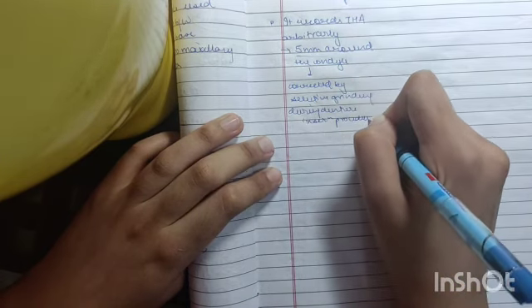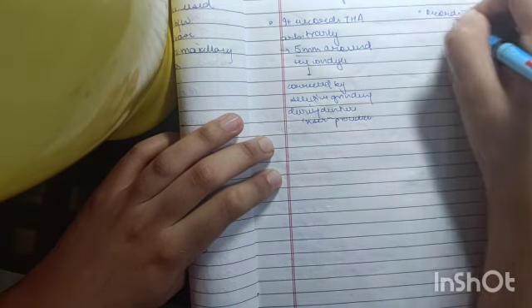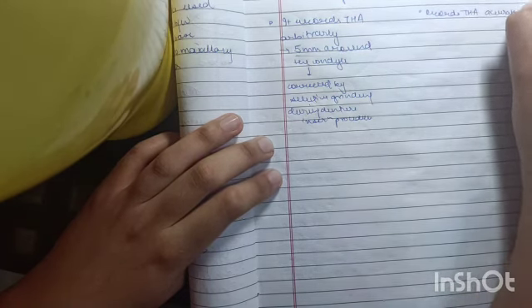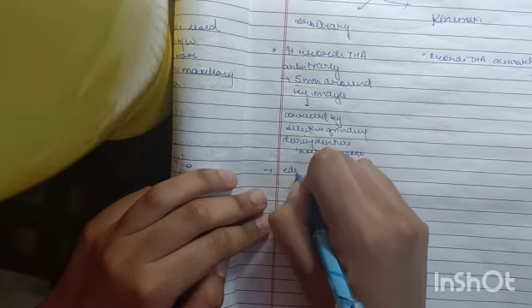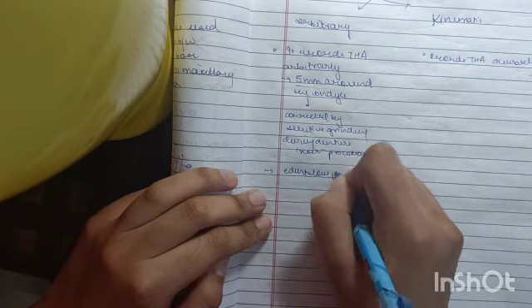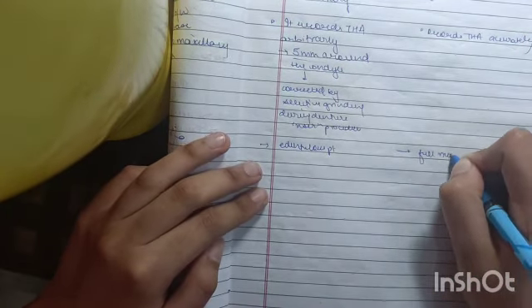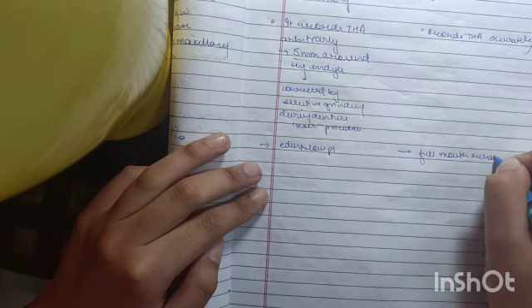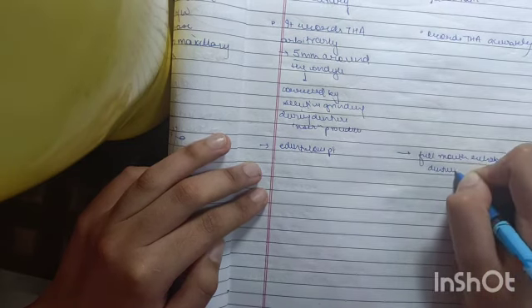Whereas kinematic records the transverse hinge axis accurately. Now, arbitrary face bow is mostly used in edentulous patients, and kinematic is used in patients who require full mouth rehabilitation or in dentulous patients.